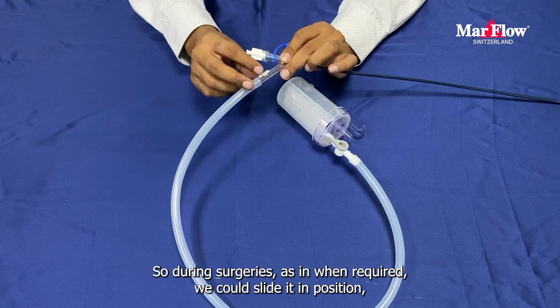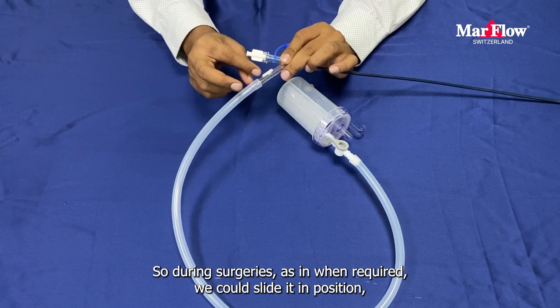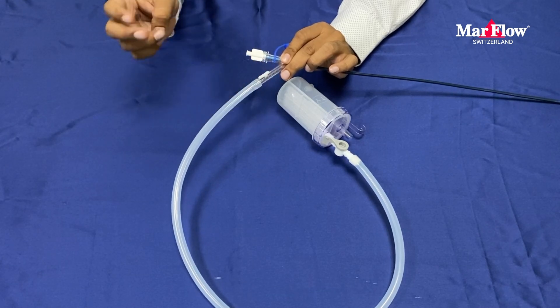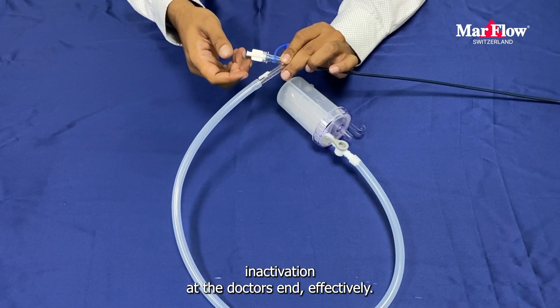So during surgeries, as and when required, we could slide it into position for the activation of suction and inactivation at the doctor's end effectively.